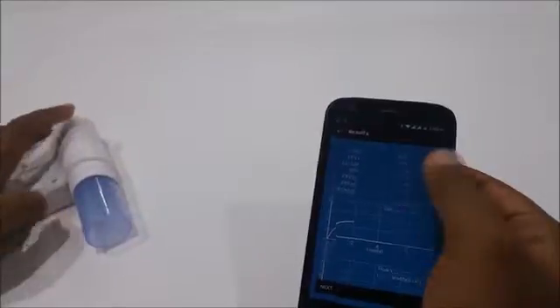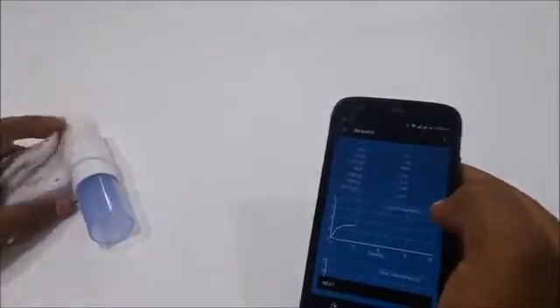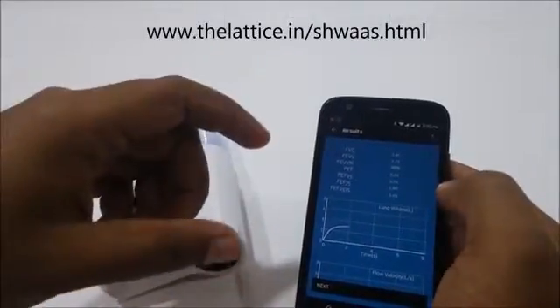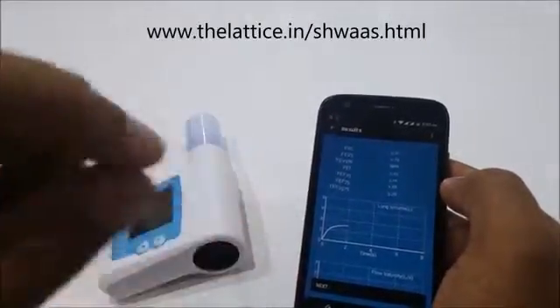You can see it on the screen here. You get a list of parameters which are pretty standard for a spirometer — you've got FVC, FEV1. All the details of what each parameter means are available on our website, so if you have any questions or clarifications, you can check that out.